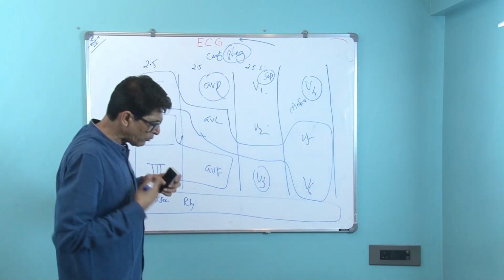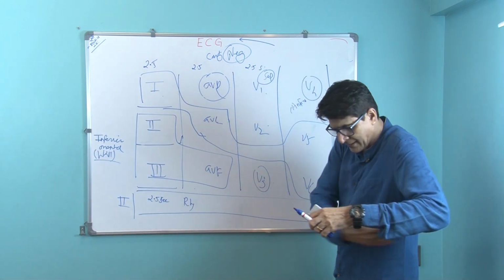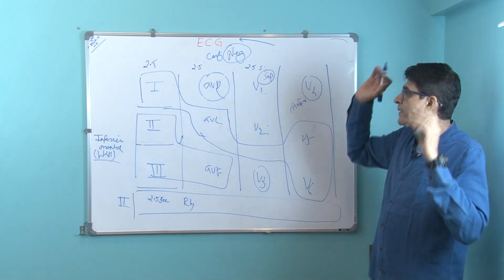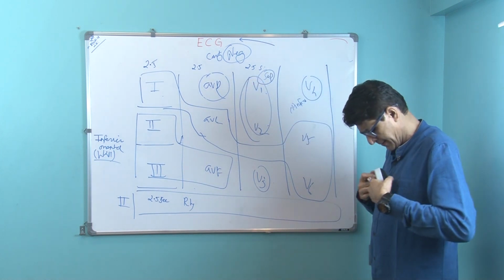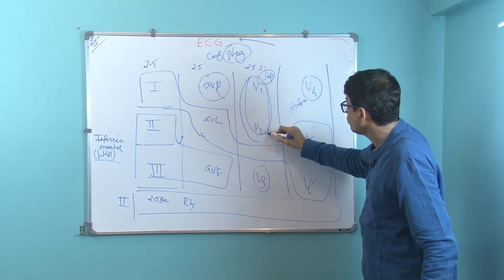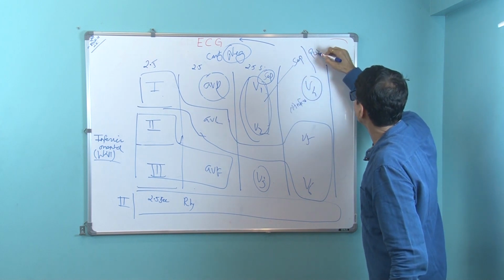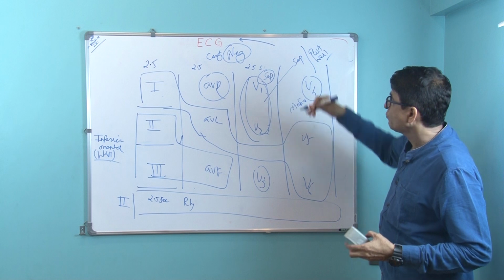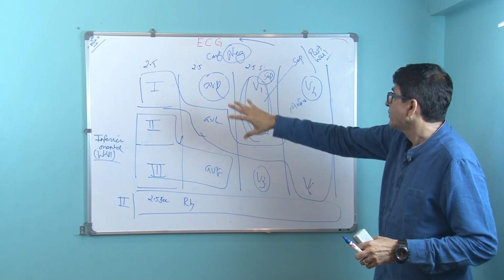Again, V1, V2, are there no posterior leads? Yes, there are, but we do not usually take them. Posterior leads are V7, V8, V9. Usually nobody takes them by default unless you are suspecting a posterior MI. But you do get, this is septum and this is septum, exactly posterior. So V1, V2, though septal leads, also reflect the posterior wall of the heart, the back side. When we come to acute coronary syndrome, I will tell you how it is reflected.